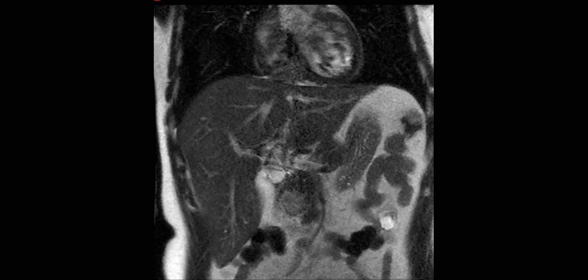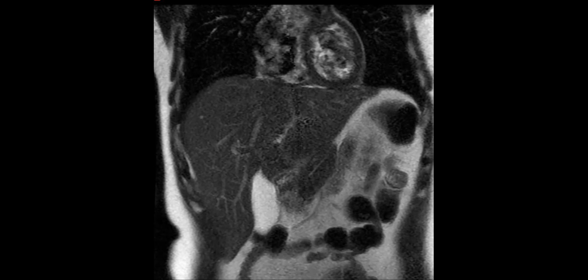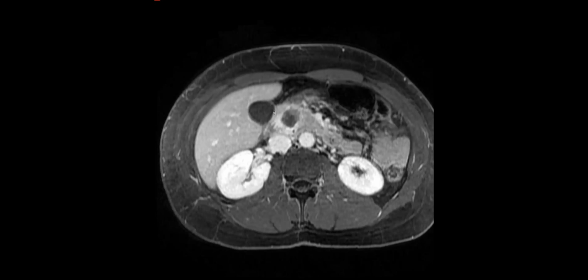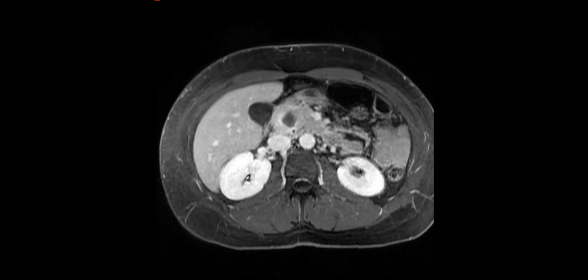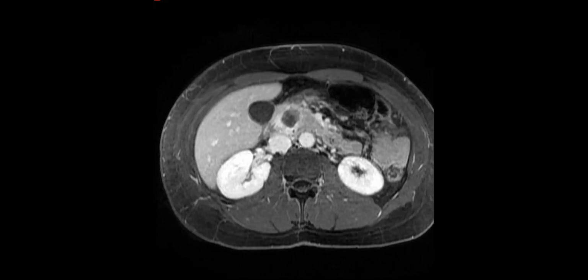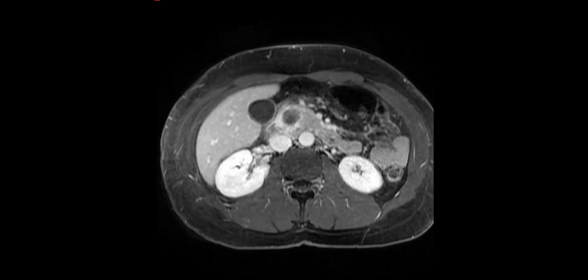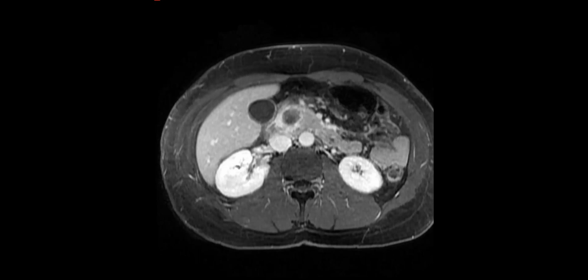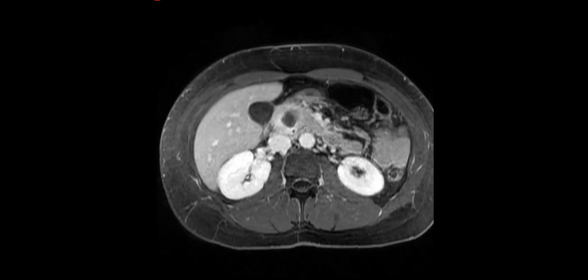Yeah, so this was resected. She underwent a Whipple, and it was a cystic neuroendocrine tumor. And as Arthi astutely noted, that rind of enhancement and then also the smudgy enhancement internally, those are two signs. It's hard to see the smudgy enhancement on the CT, but maybe better appreciated on the MR.